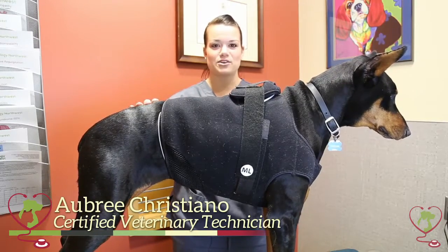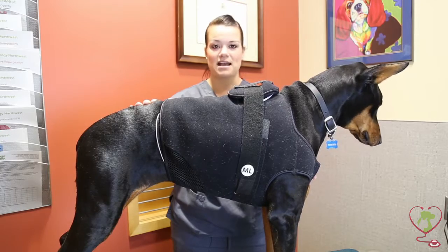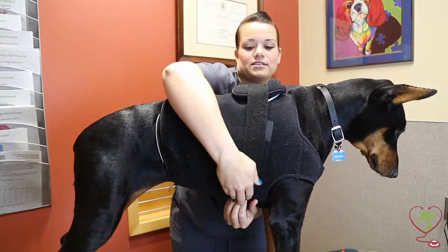Now that it's been 24 hours, I'm going to show you how to remove the Holter monitor at home. You can easily do this without having to bring your dog back in. Everything is easily velcro and easily removed, so you'll want to take off the belt first.